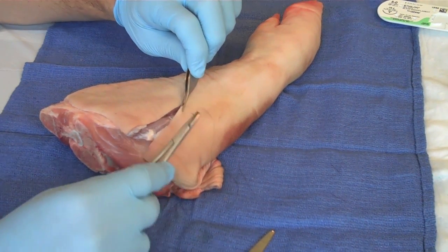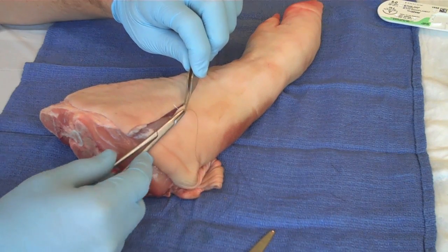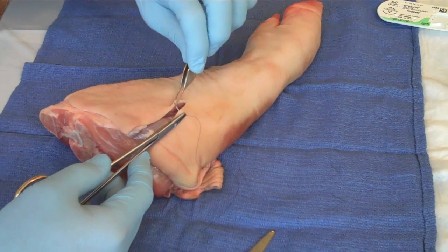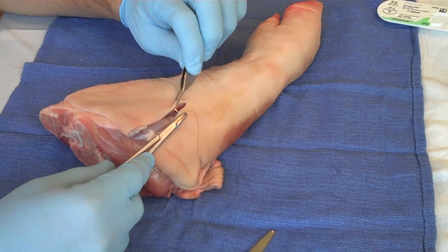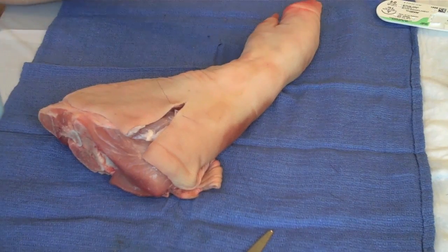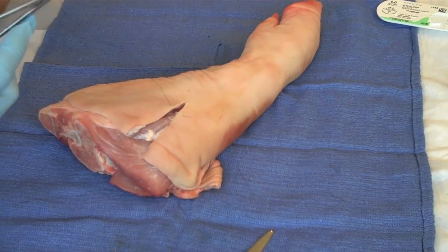Basically same technique: you flip your edge up, enter 90 degrees, take a bite, flip your wound up, take an even bite at the same point, same depth — be mindful of the planes that you're using. Don't pull the thread all the way through.